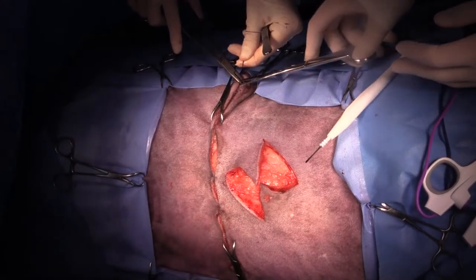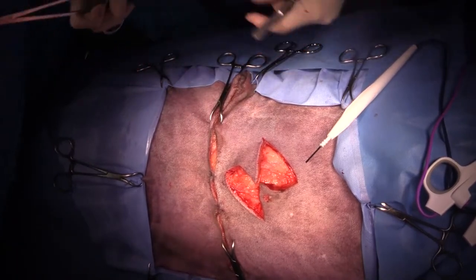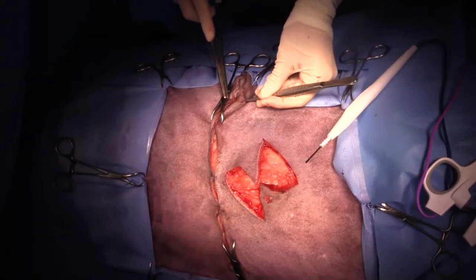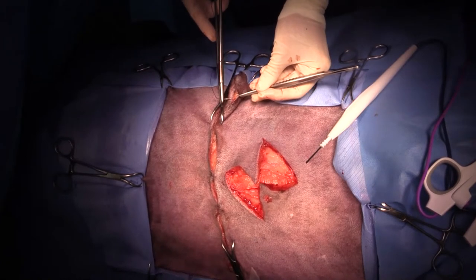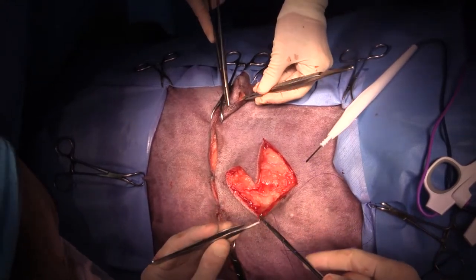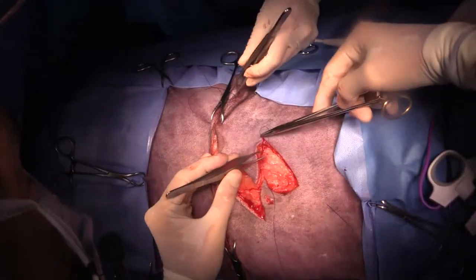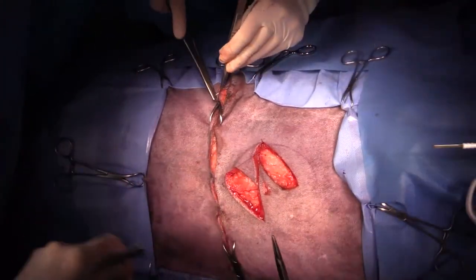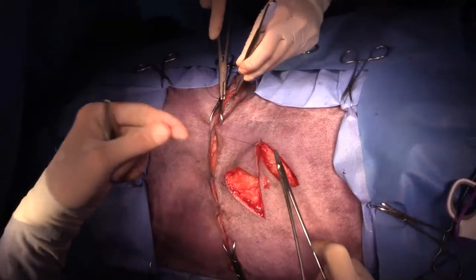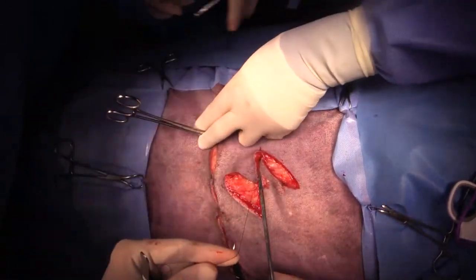Can I get some 2-0 PDS, please? Yes, please. And so as far as how much tension is too much for primary closure, it really is just kind of an educated guess. I don't know that you can say that so many newtons are too much. It just feels like when it's under quite a bit of tension, based on experience, it's going to dehisce. Yeah. Cut, please, Michael.